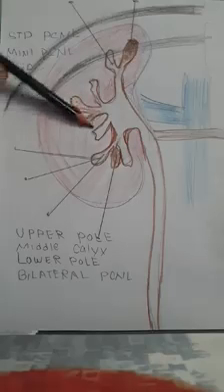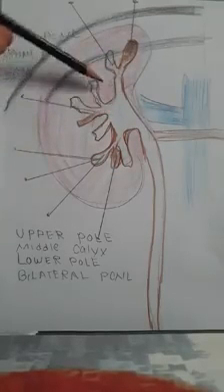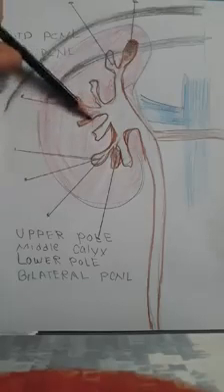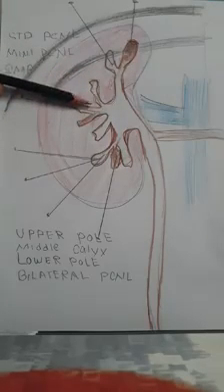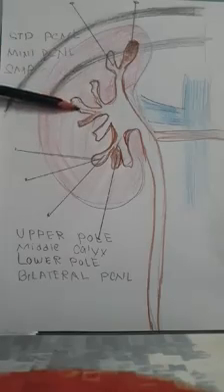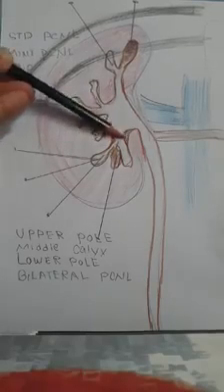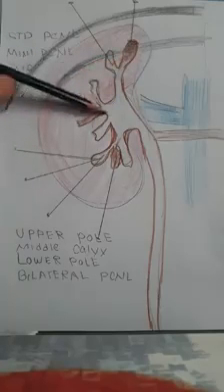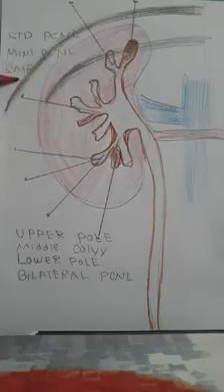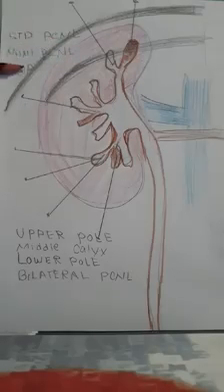That's all. You cannot really try to manipulate around the kidney, because the kidneys have too much different angulation, and there is no access sheath. If you have an access sheath, you have more leverage to move the scope. So in super mini, I found that if there is a stone here, you can just go there, you can dust with the laser, and the job is finished. But if you want to go to the upper calyx, if you want to maneuver inside, there is less maneuverability in super mini PCNL. Unlike mini PCNL, where we have much more leverage in maneuvering.